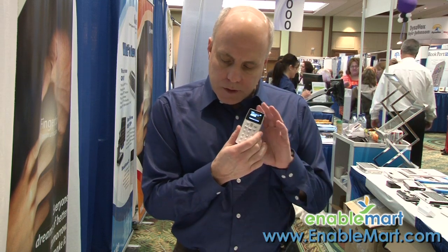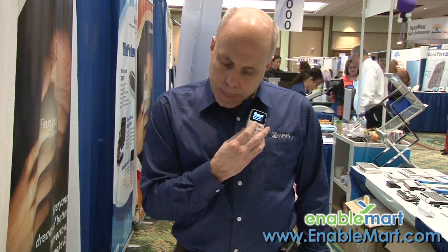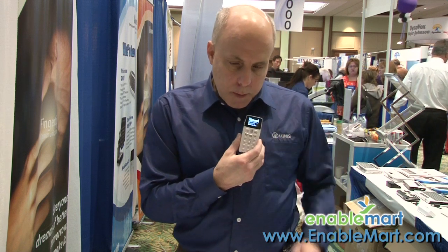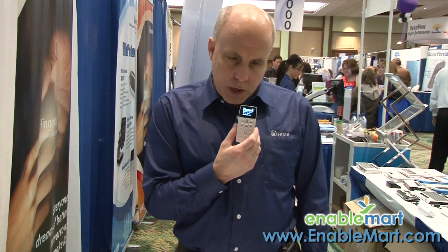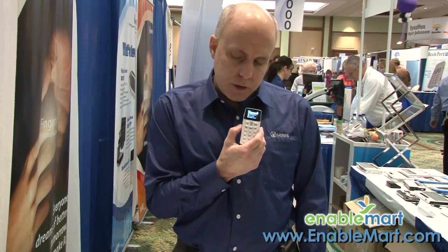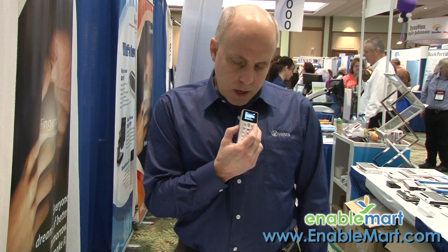Let me show you what else is available on here. I now went back to the main menu. You heard the word BookShare, and I've talked a little bit about BookShare and what it has available. It is a great service if you are a student. It is free of charge as well, and there are thousands and thousands of books. And there's the NFB Newsline.